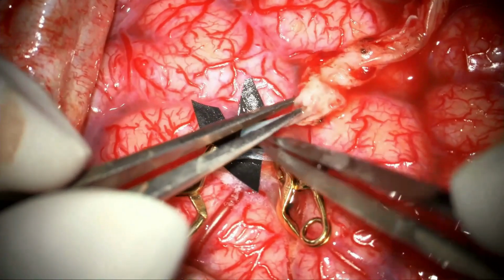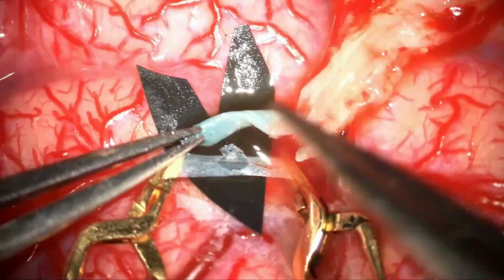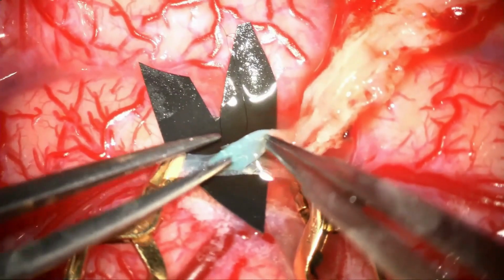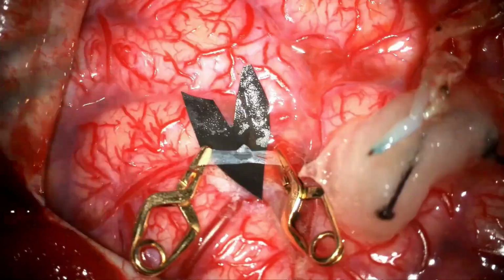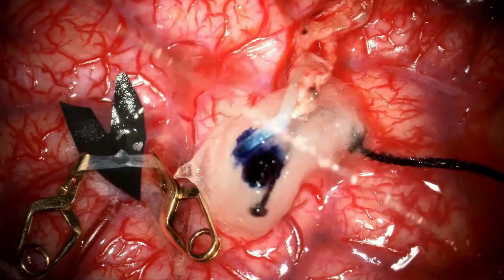Donor and recipient are matched just before starting the anastomosis. The donor vessel end is again stained with dye.